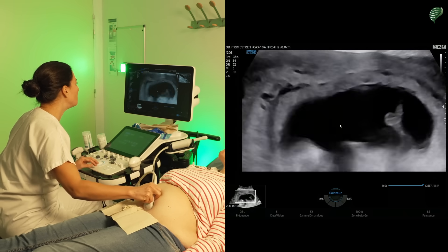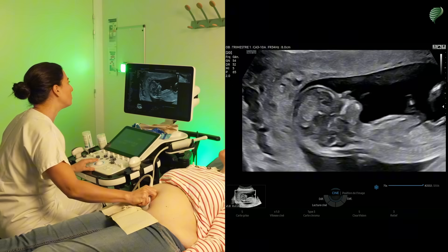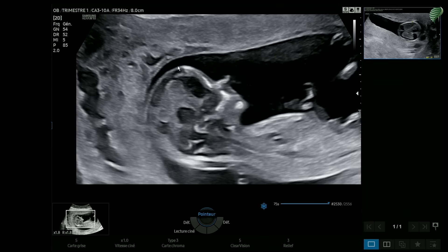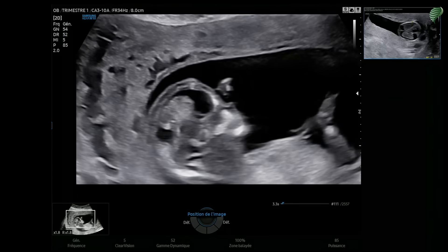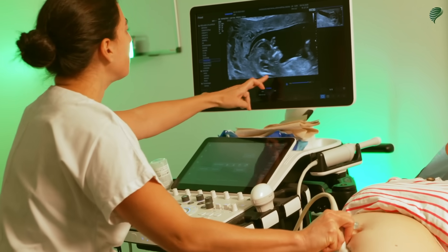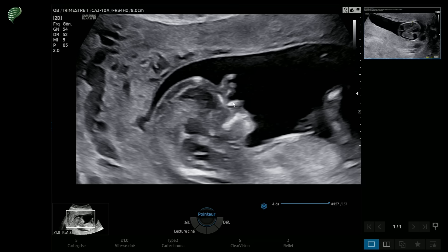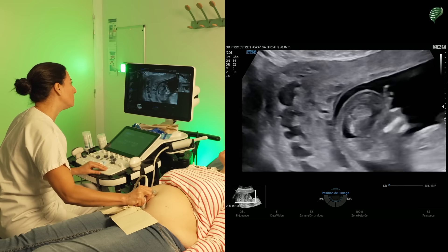We can also explore the face in the sagittal plane to look at the profile. I've turned my probe 90 degrees and I see the profile with the forehead, nose, mouth, and chin. When I'm perpendicular to the nasal bones I can highlight them — the nasal bones are visible here. Be aware that in an ultrasound centered on nuchal translucency, the beam is not perpendicular to the nasal bones, which are not in the same plane. To see the nasal bones you should have them as perpendicular as possible to the beam. Here the nasal bones are well present and we also have the palate.